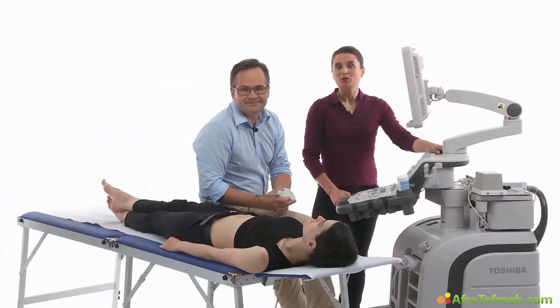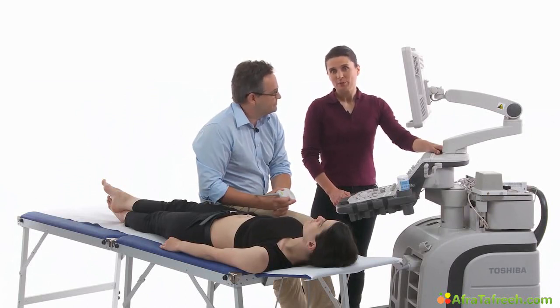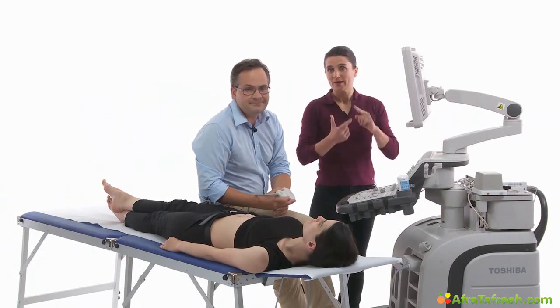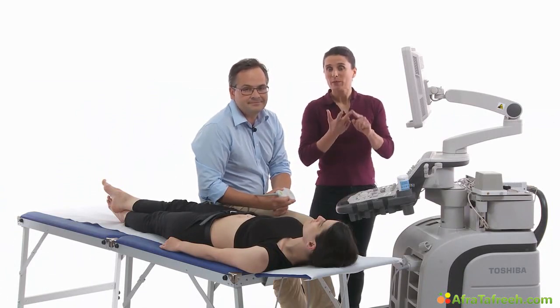Of course, we want to get good results with our ultrasound scan. To be able to thoroughly assess all the organs, it is important to have an optimal picture. We need the right frequency, the right gain, the right depth of the picture, and the right focus.